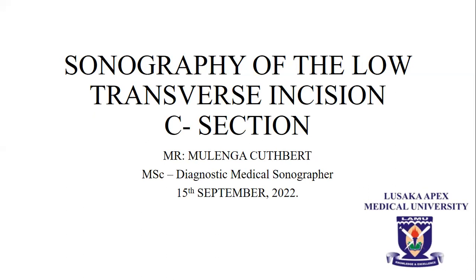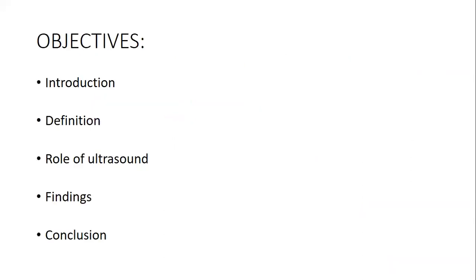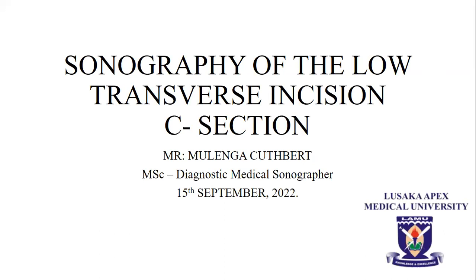And I've also realized that when something unusual comes, sometimes you don't even know what to write as a sonographer, as a radiographer, simply because you may not really know exactly the clinical question and what exactly is being asked. But I'll try to explore some indications and reasons why patients who have undergone Cesarean section are brought to our department. And not only that, you also realize that complications may arise after Cesarean section.